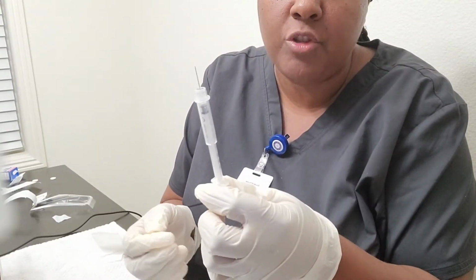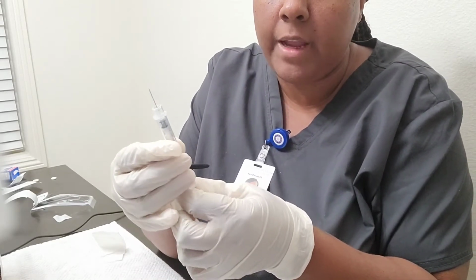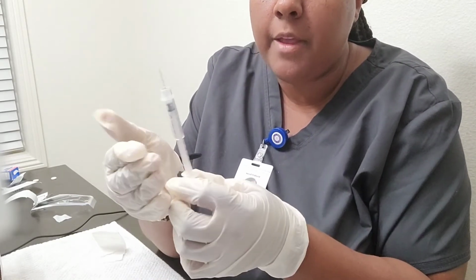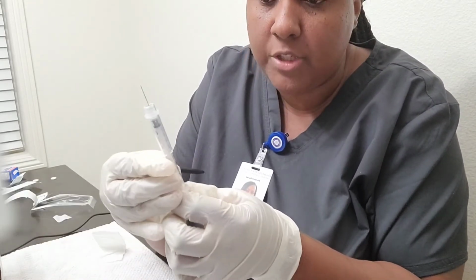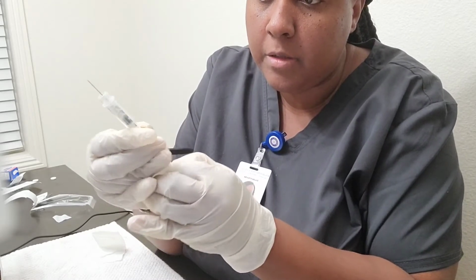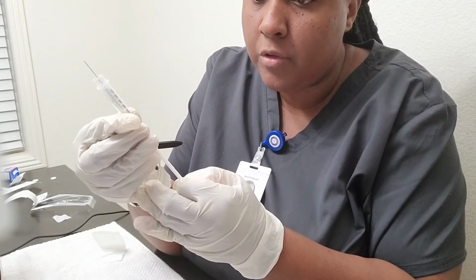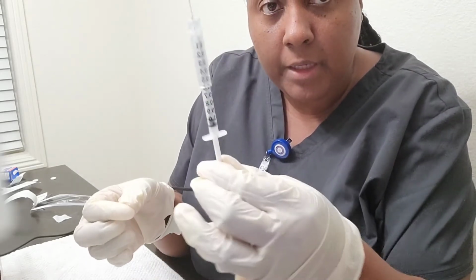Okay, so I will then go ahead and draw back the amount of air on the plunger. I will pull back the amount of air as the medication, which is the dose, which is 1 milliliter. So I will draw back to 1 milliliter.